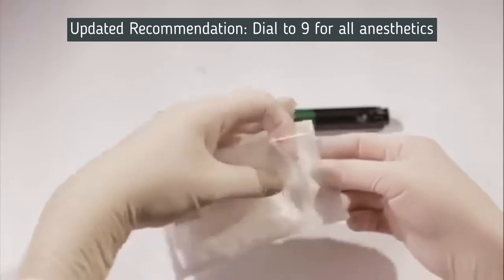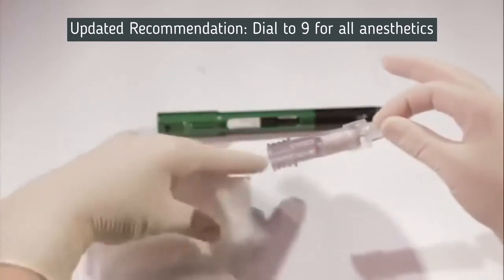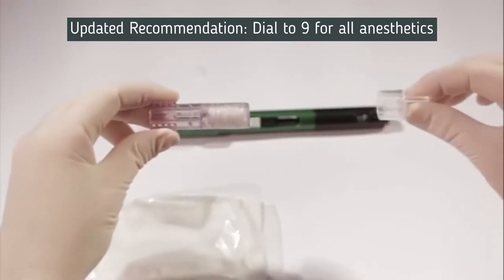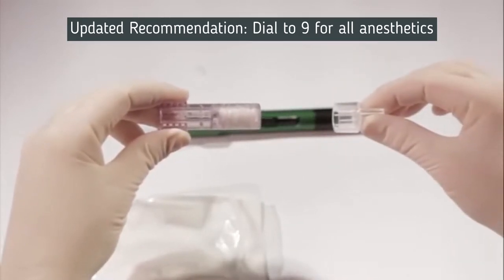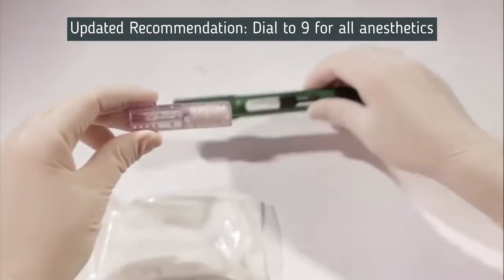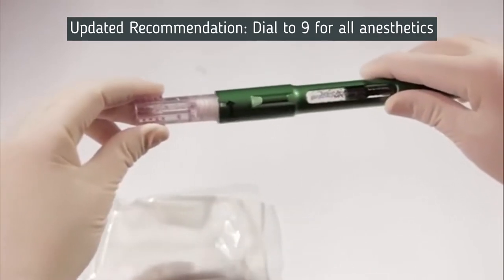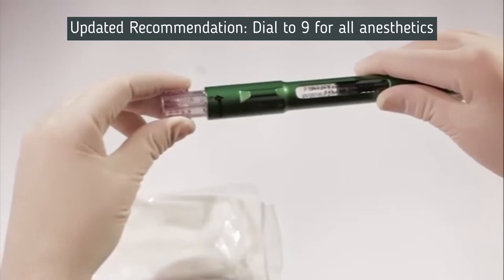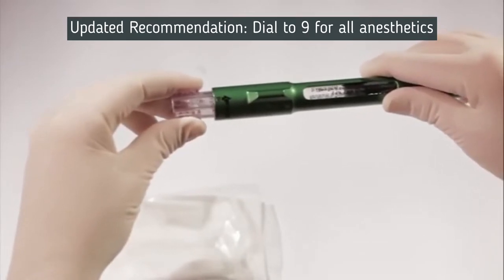Remove a disposable cartridge connector from its sterile packaging and carefully remove the safety cap. Don't try to twist or unscrew the cap — it can be easily removed by pulling it straight off. Align the arrow on the cartridge connector with the number 1 position on the pen's chamber and push in approximately one quarter inch until you hear a click.